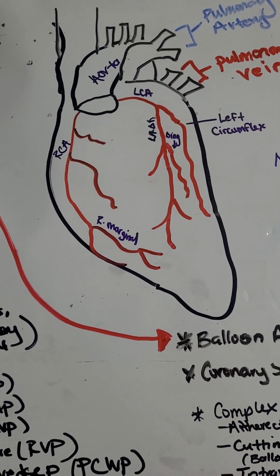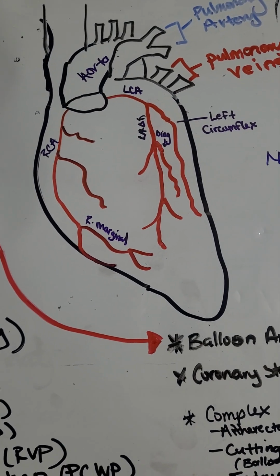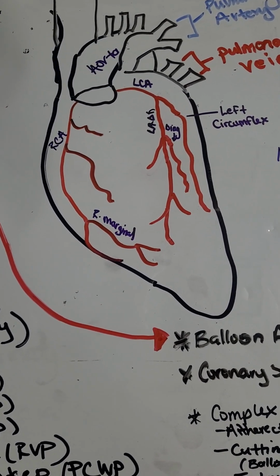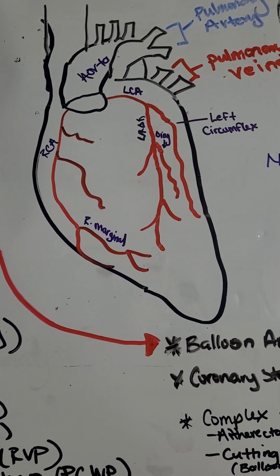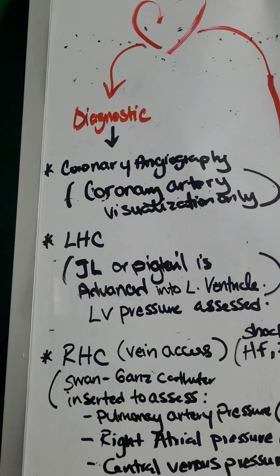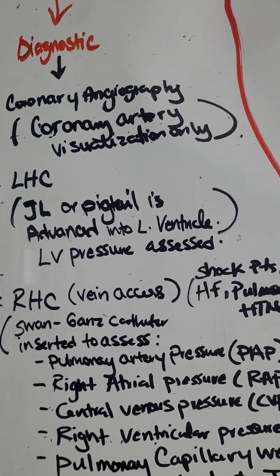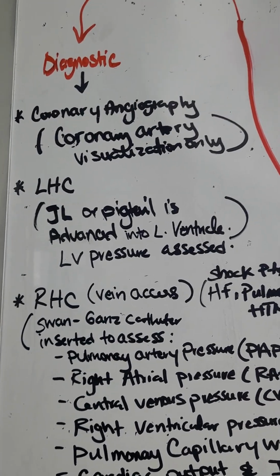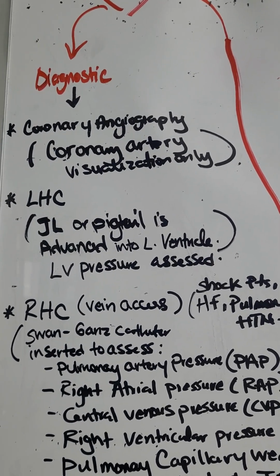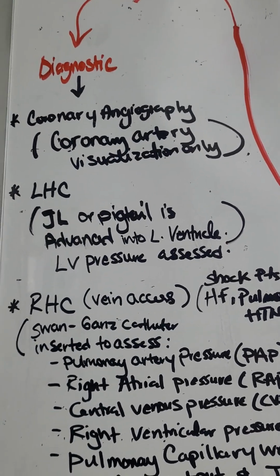But if this is just a regular diagnostic case, the patient has been having chest pain, or they've had a stress test, an abnormal stress test, the doctor will do just a diagnostic, right? So there are several different diagnostic tests that we can do in the cath lab. Diagnostic just means they're trying to diagnose what is causing the abnormal stress test, what is causing the issue at hand, right? The baseline issue.